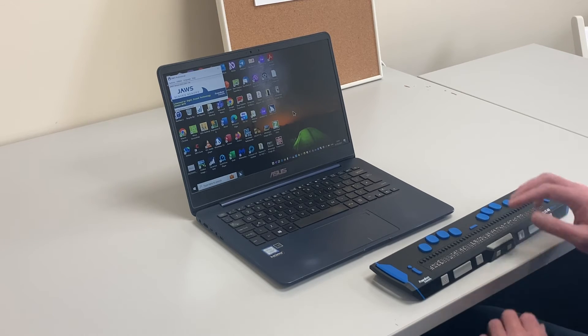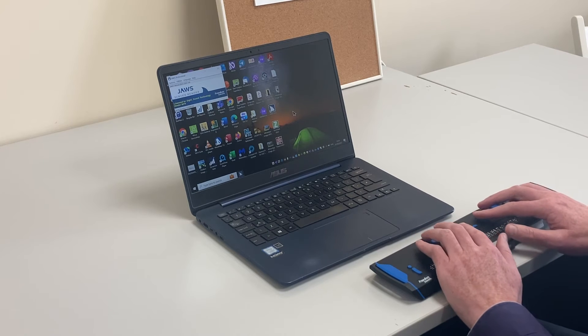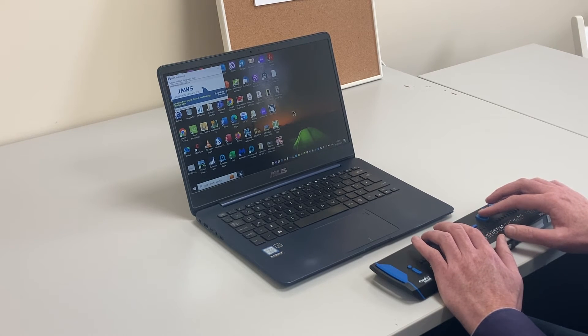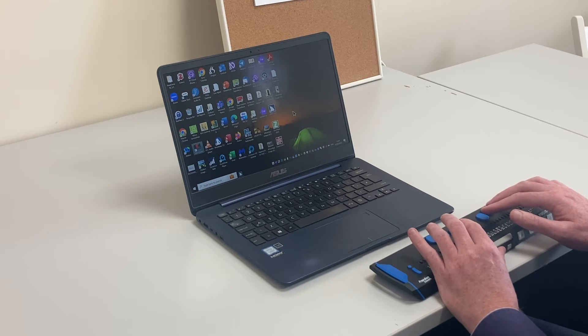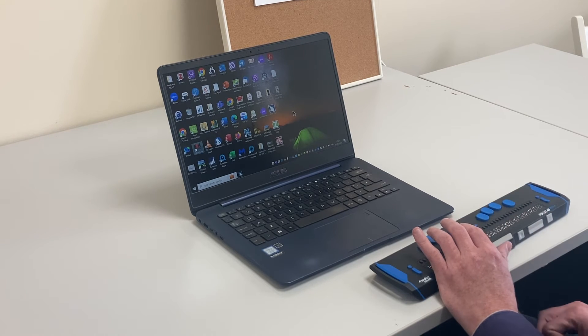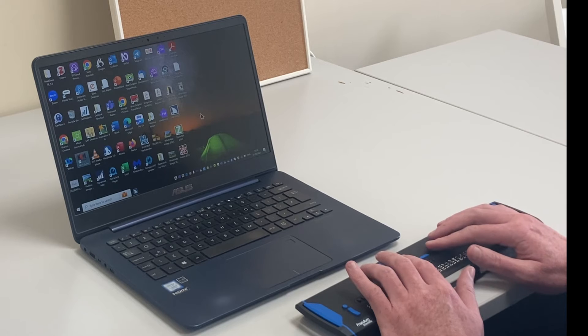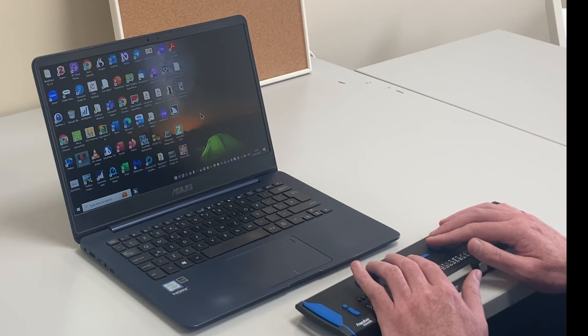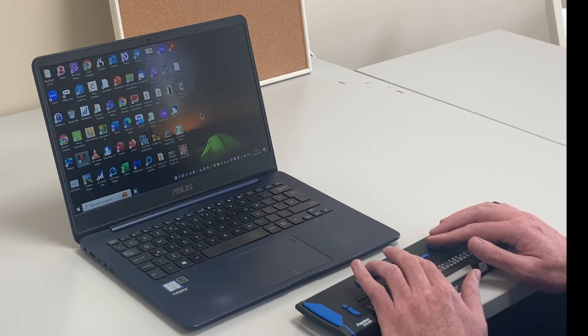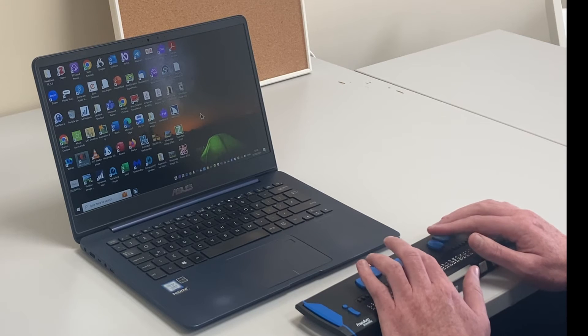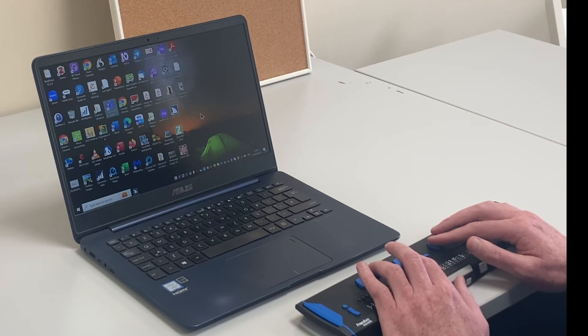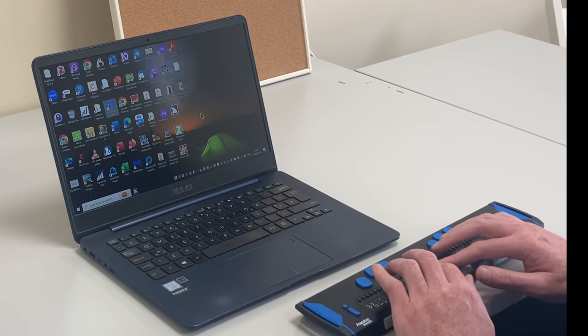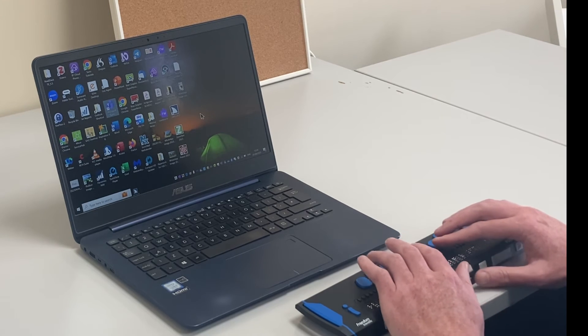I'm going to go to my desktop by pressing a combination key on the Focus Braille display. I'm now sitting with Focus on my desktop. I can use first letter navigation, for example, pressing the letter M to find Microsoft Teams. And of course, I'm also seeing Microsoft Teams on my Braille display.